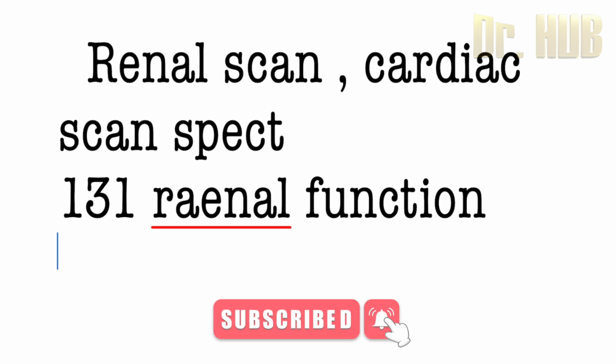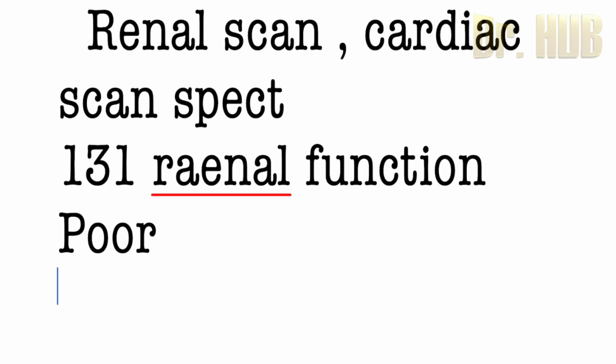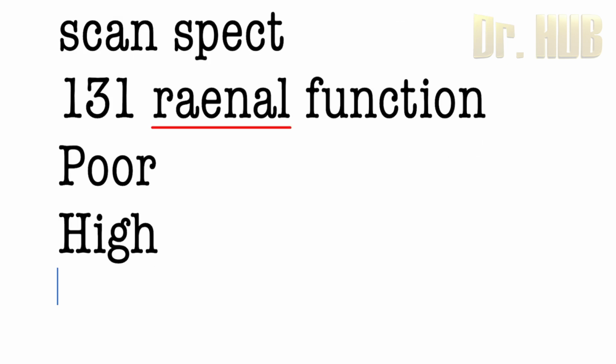Image quality is poor. The radiation dose can be high, and hence it is no longer used routinely.